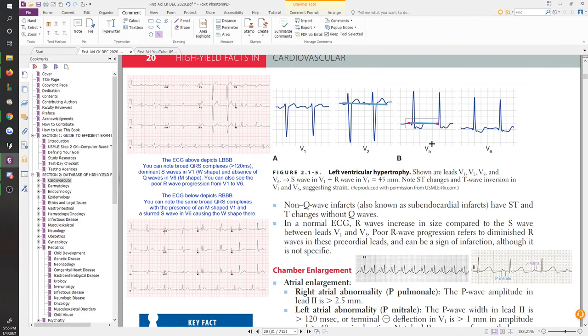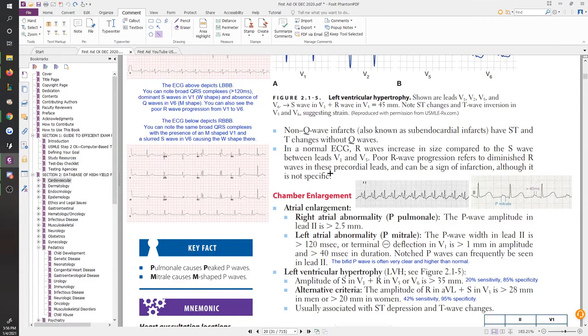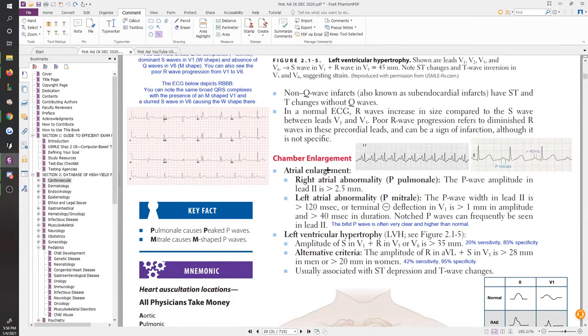Right, so there's definitely ST changes that you're going to immediately start using to think, okay, this person might have had an MI, either subendocardial or transmural, doesn't matter. An MI is an MI. You start giving the patient the treatments they need for their MI, and eventually put them in the cath lab and catheterize their hearts and take out anything that you need to, right? Put stents in wherever appropriate. But some of the more appealing things to catch are the atrial enlargement things, okay?